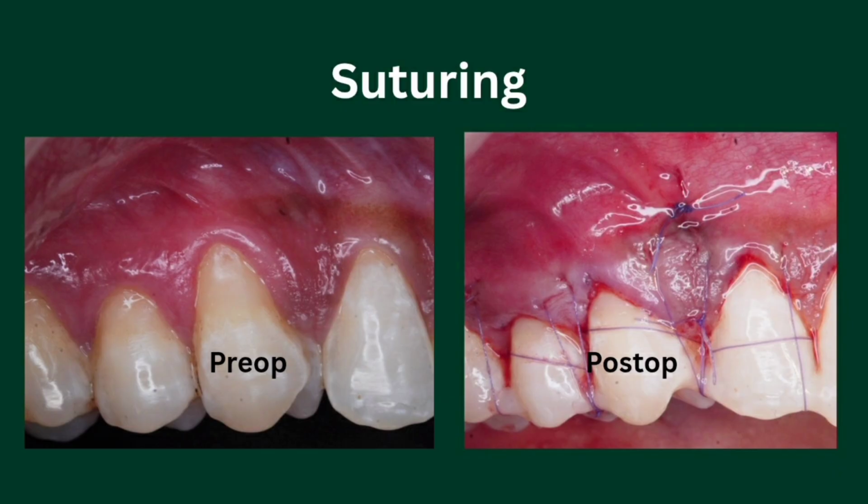This is the comparison of pre-operative and immediate post-operative pictures. The recipient site sutures can be removed after around 2 weeks.